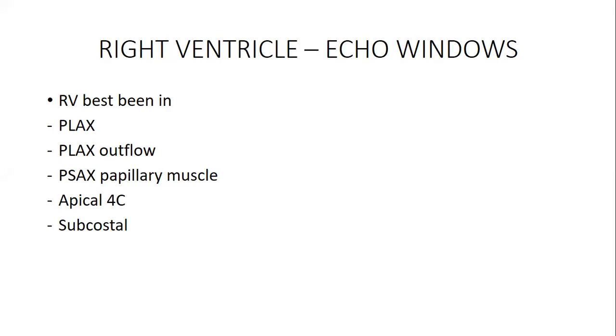So what do you need to do? You need to switch on TDI, tissue Doppler imaging. You do your tissue Doppler imaging, and you can also measure the volume of the left atrium, so that when you are limited with your E/A ratio, at least you can use these two parameters to conclude. The point I'm trying to put across is that you should not conclude echo on only one image, because that can be so misleading.